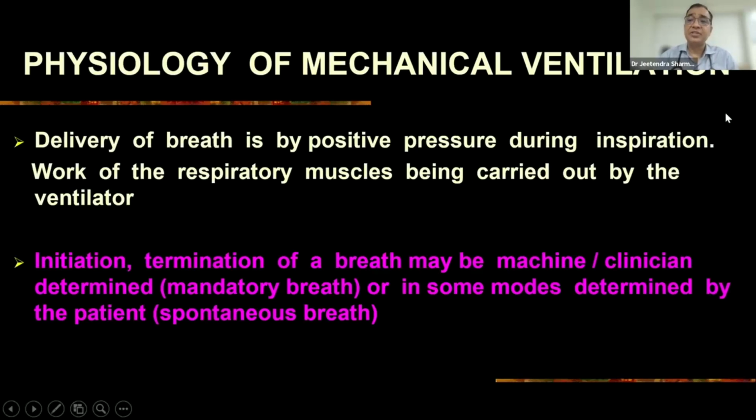In this lecture, I will give you the very basics about ventilation, a little bit about the mechanical ventilation machine itself, and a simplified way to understand the modes of ventilation. So what major change happens, and what is the mechanical ventilation machine? How can you actually define this machine?